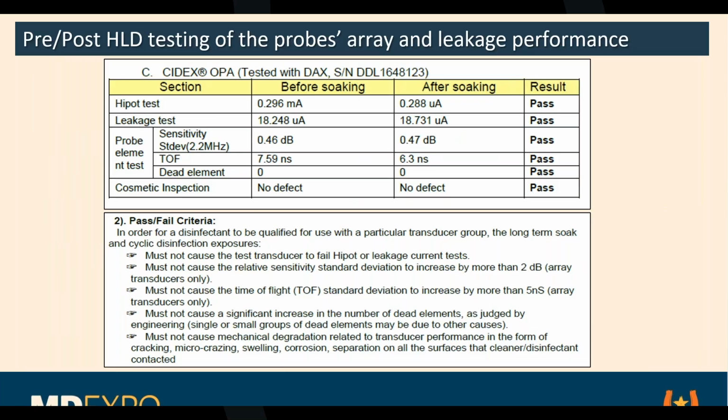If you have fluid ingress into that, and these chemicals are nasty, some are really nasty, they can get in there and destroy the probe by going through the lens. And lenses always get poked and perforated by imaging, biopsies, putting in a central line or a venous line. A lot of things can happen to those, so you need to go through those kinds of issues as well.